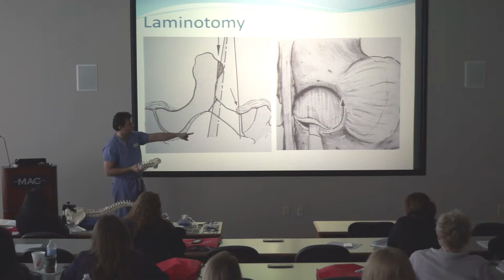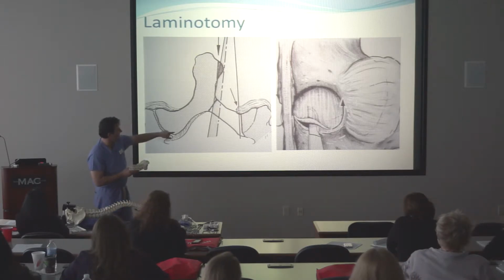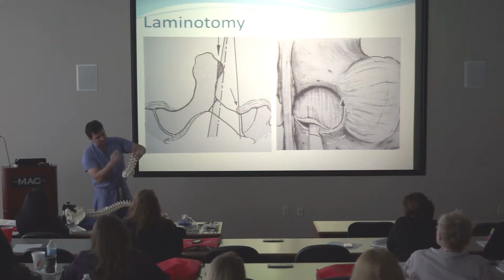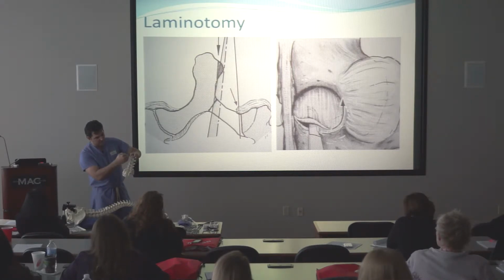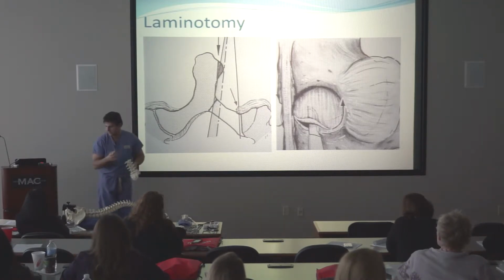And on the right side, we don't just jab a knife in there like that. I hope you guys realize that. It's just a cartoon of how we do that, because you'd be out of practice pretty quick. So you're basically going to release the ligament that's in between the bones here. This model doesn't show that. You'll see it in the cadaver. There's a ligament in between these bones that basically covers the canal, okay? So you have to kind of release that ligament in order to move it out of the way to get a better vision or get some visualization inside the canal to look at those nerves, okay, and get them out of the way to get the piece of disc out.